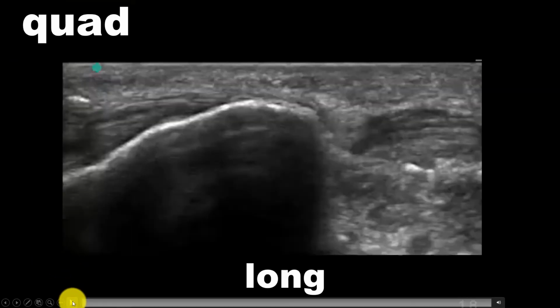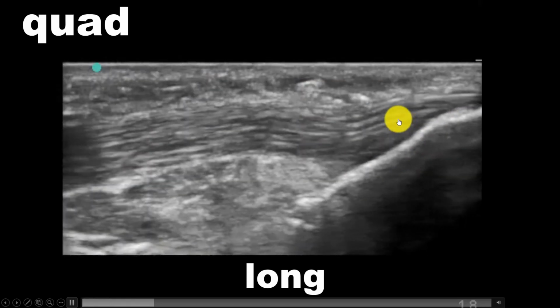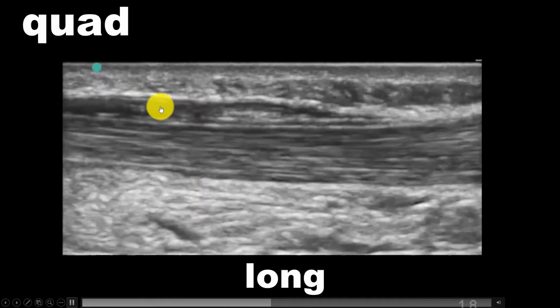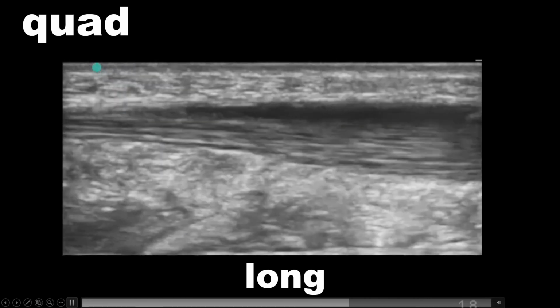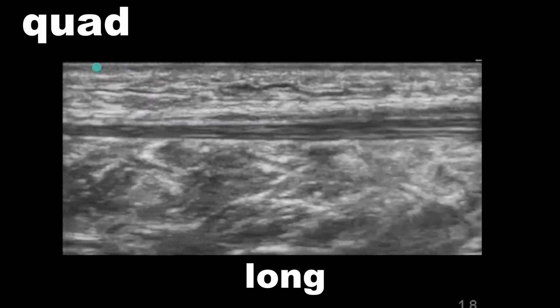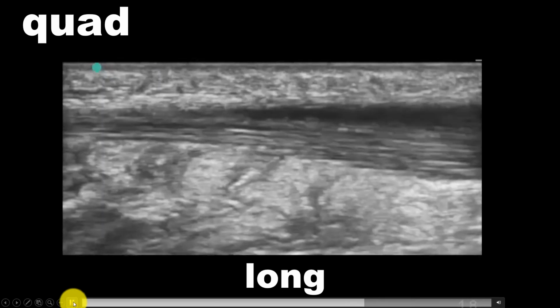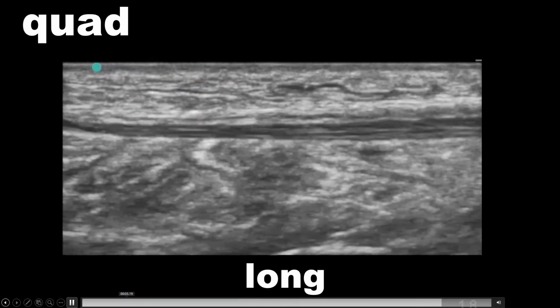And here is another example. Now you're looking at another quadriceps tendon, and as we're scanning from the patella upwards, you notice that the tendon fibers appear intact and normal. But as we progress upwards, you're now noticing this dark anechoic fluid collection sitting right above the tendon. It's a little unclear what this might be. It might be indicative of tendinosis or chronic inflammation of the tendon, or a small partial tear with layering hemorrhage in the tendon sheath itself. But again, notice that when we're at this point, we're doing a very careful fan to see if it's changing color, and we're noticing that it does not.